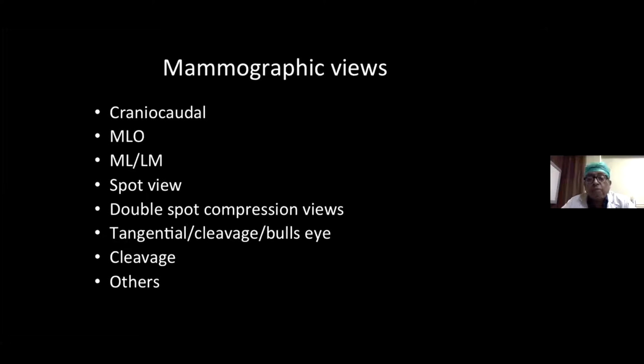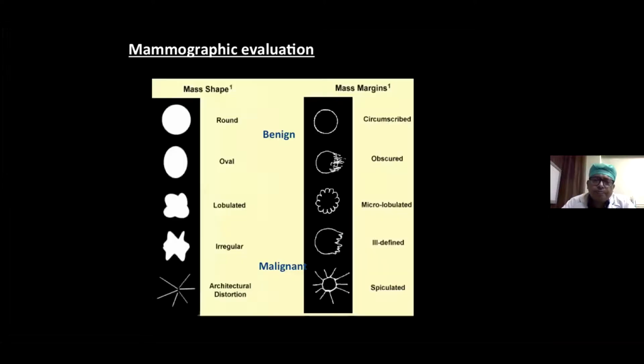But at times, in certain lesions where we have doubt, we may have to choose any of these views so that we can upgrade the Birads 4 lesion.